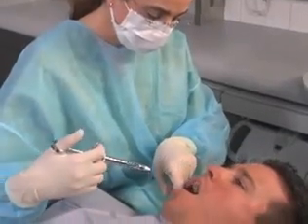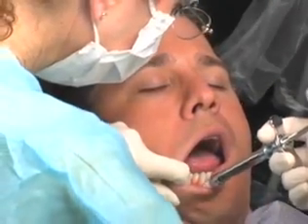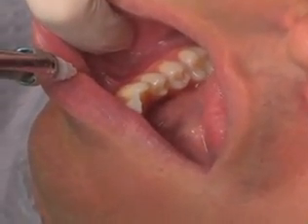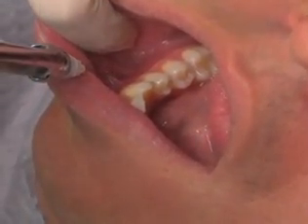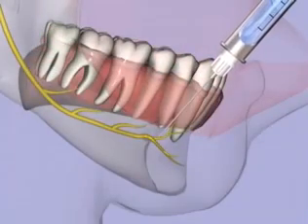For the right or left incisive nerve block, the barrel of the syringe is kept below the patient's line of sight, and the needle inserted into the buccal fold adjacent to the first premolar, and then advanced until the needle tip lies outside the mental foramen.